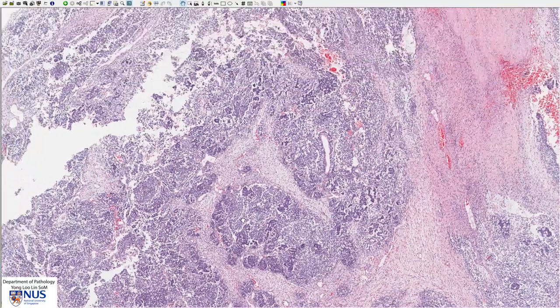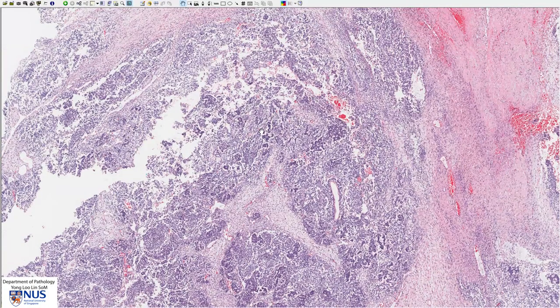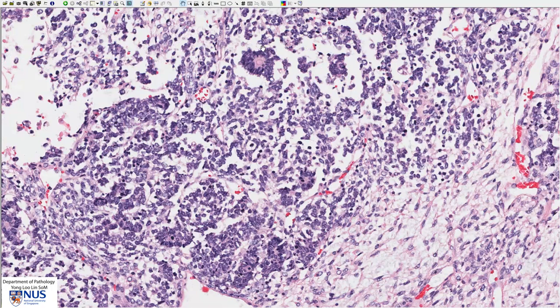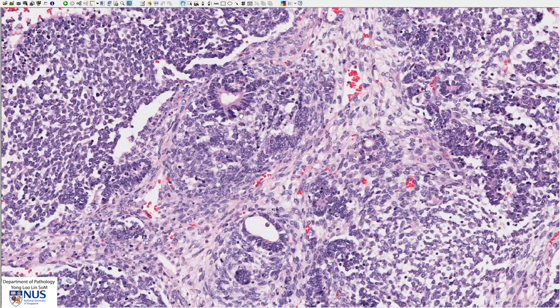Next we will look at the epithelial component, which is better seen in this area. As we zoom in, we can see that there are some tubular structures. Some of them appear to almost be like a rosette — a very tight circular structure composed of nuclei. In other areas we have better formed tubules. The tubular areas form the epithelial component. Sometimes we can also see glomerular-like structures and occasionally even squamous epithelium or mucinous epithelium, but they are mostly in the form of these tubular structures.